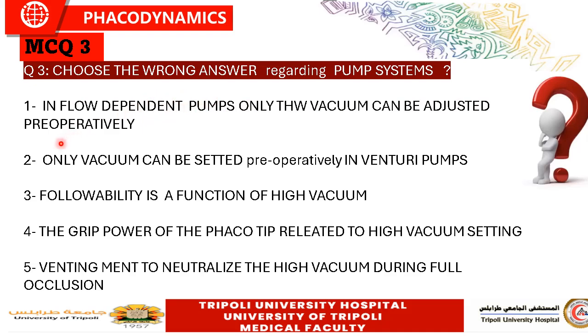pumps. Only vacuum can be set preoperatively in Venturi pump. This is true because only the vacuum is linearly controlled by the Venturi pump. However, the aspiration flow rate is indirectly controlled by the vacuum. So we can set preoperatively only the vacuum.